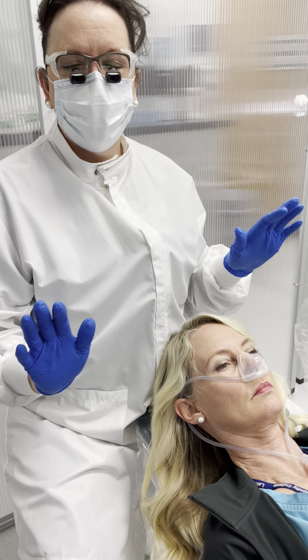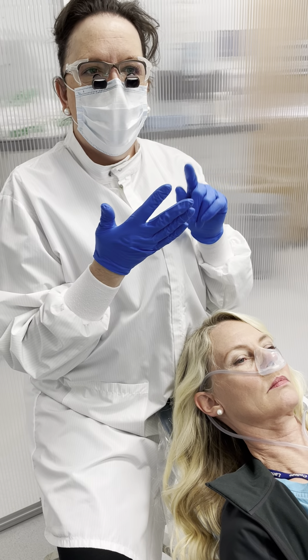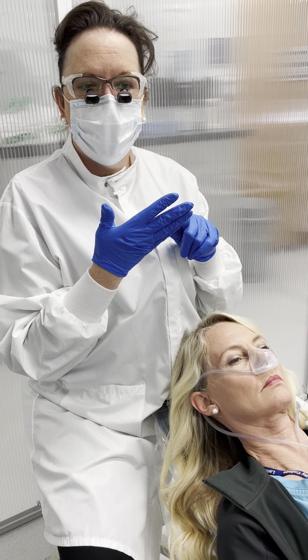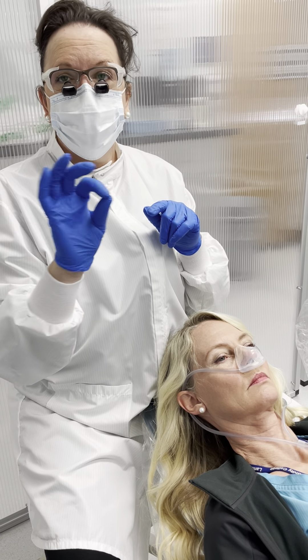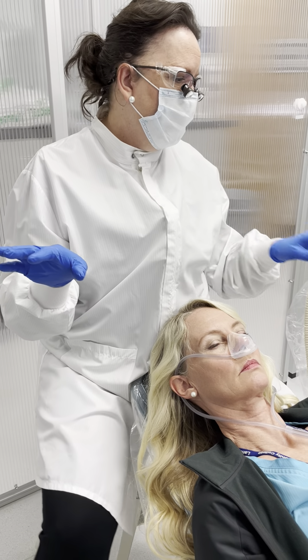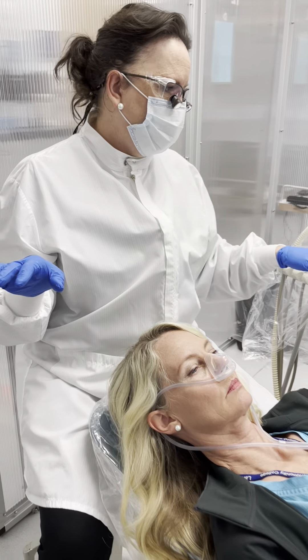We're going to make an assumption that before we do this procedure we check the patient's vitals and have documented those. We do need to keep track of those items, so have somebody jot it down if you can't get immediately to the chart. Pre- and post-vitals are required by law.